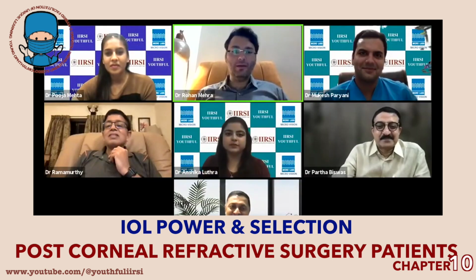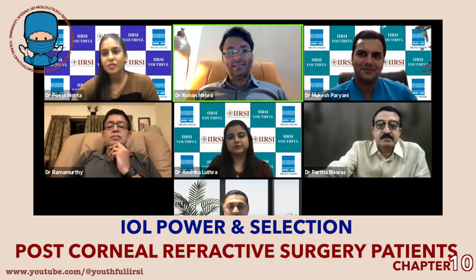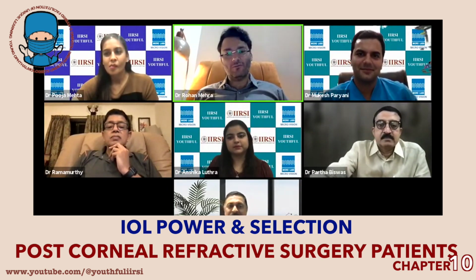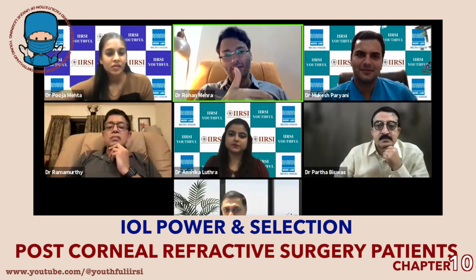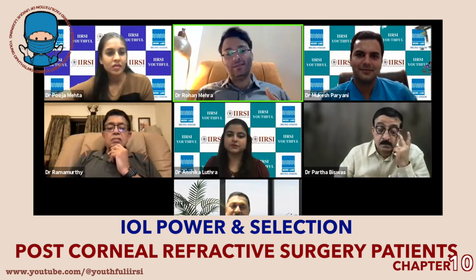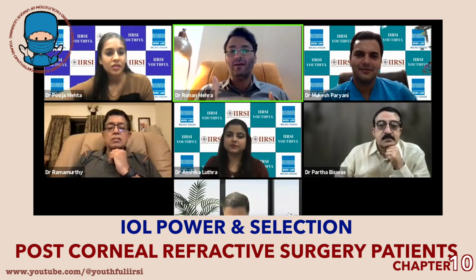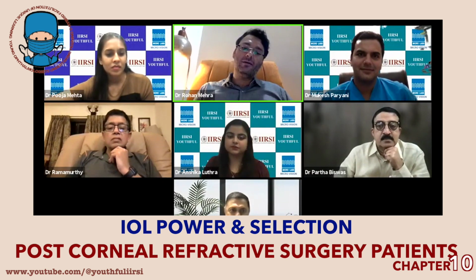Absolutely. Because I remember reading an article very recently that 66% of closed CPA cases in England were actually because of faulty biometry. So it was not what you did in the surgery per se, but what happened in the biometry part of it that the doctors actually had to pay the patient. Biometer, most definitely, invest in it.